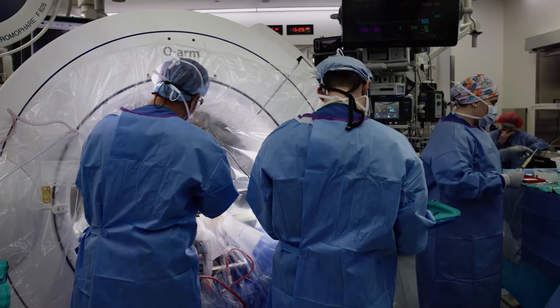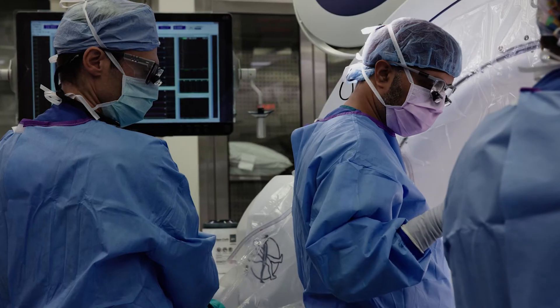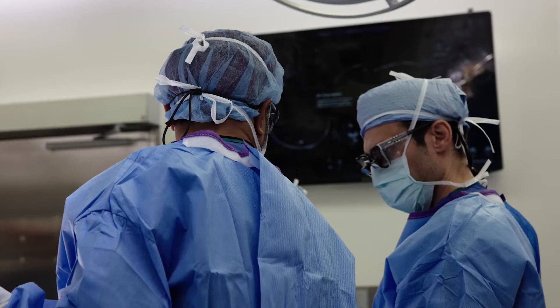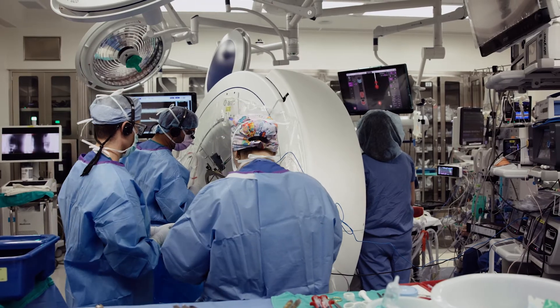Deep brain stimulation is a minimally invasive procedure. It can be effective at treating conditions such as essential tremor, Parkinson's disease, and epilepsy. The idea is that we use the brain's natural language, which is electricity. And instead of making the brain talk in a particular way, we're disrupting the brain from talking in an abnormal way.